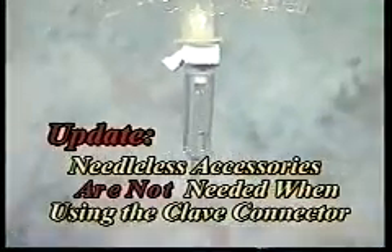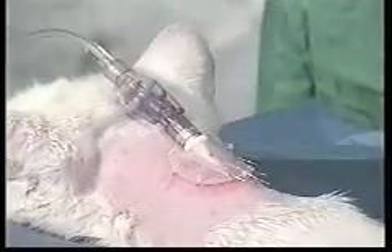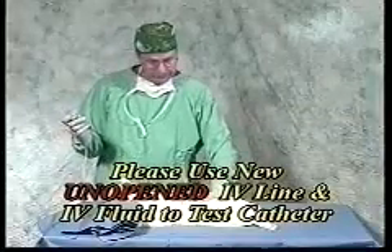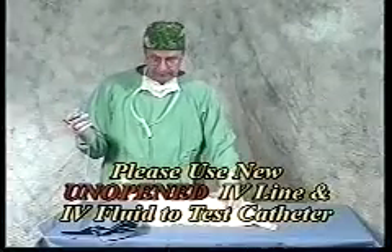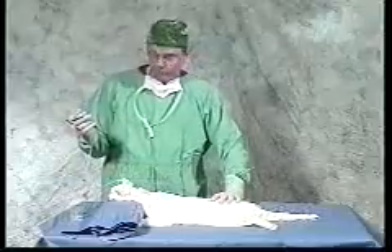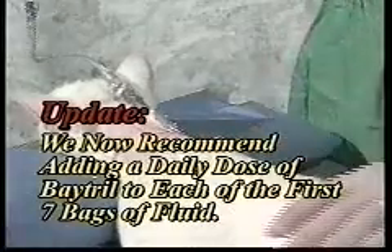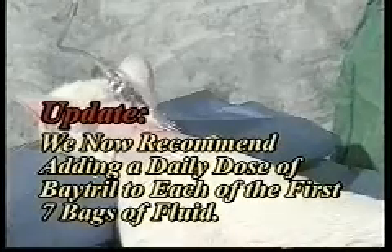Fluids run pretty much wide open through this system, just about like they were running through a 16-gauge needle. You can feel the tube under the skin — it extends back to this point on the cat and it is filling up with fluids right now. It only takes about two minutes to run a patient 200 cc, so there is very little restriction in this system.